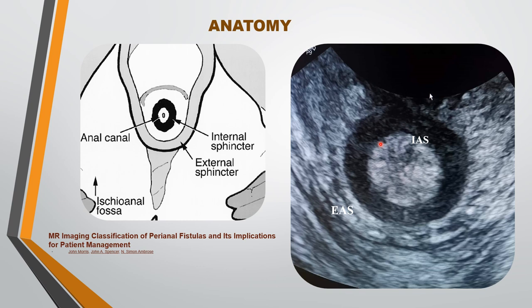Similarly, the transperineal probe was kept on the perineum just above the anal opening. Here we can see the ring-like hypoechoic structure is the internal anal sphincter. The anal lumen is covered with anal mucosa. The area of mixed echogenicity is the external anal sphincter. In axial section, the potential space between the internal and external sphincter — the intersphincteric space — is filled with normal fatty tissue.